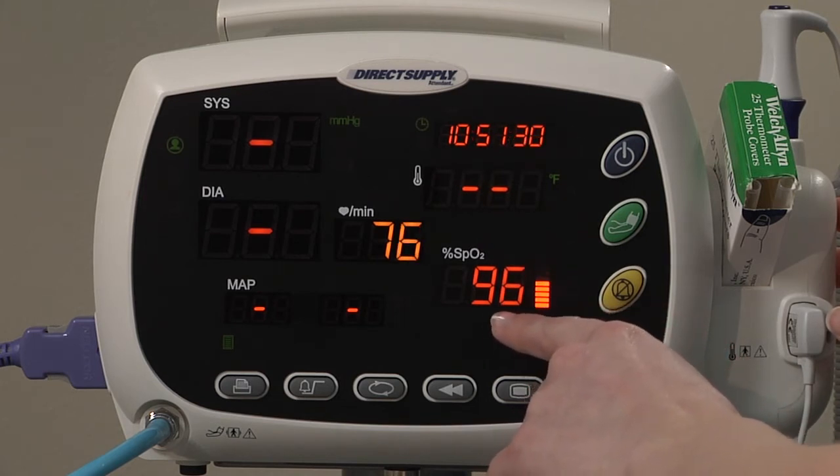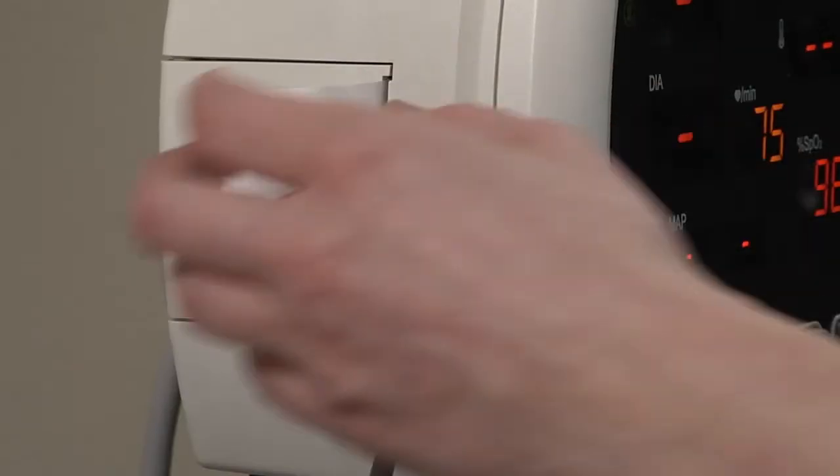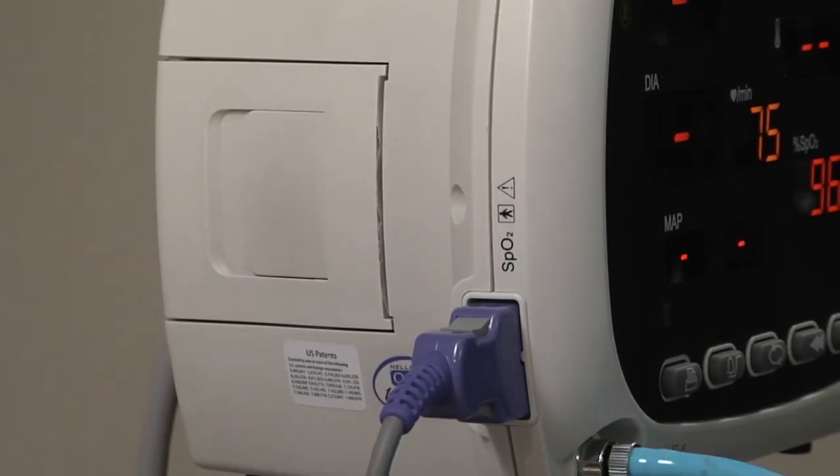Soon the pulse rate and blood saturation level will automatically display. If you have the optional printer installed, you can obtain a hard copy of these measurements by pressing the print button.